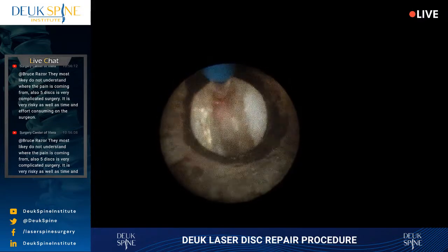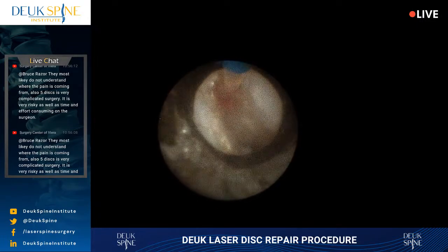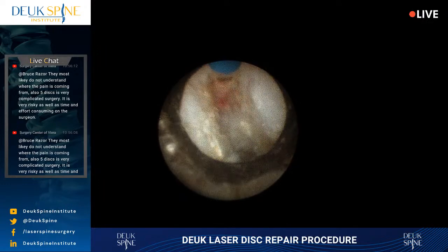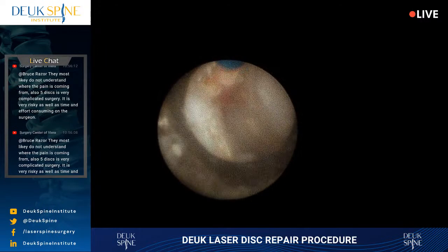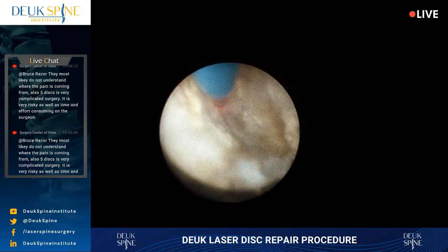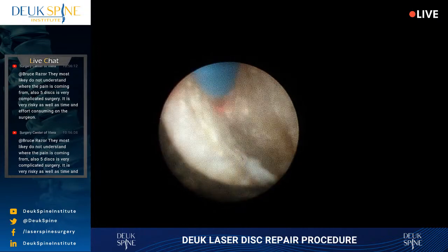All right, so already starting to see a little more movement at the back of the disc here. Luis, are you able to get more of these tubes as well? These ones are hard to get. I know, but you've got to get them. Either you find them or have them made. Okay, you understand what I'm saying? There are companies that make stuff, and you have to talk to them and say, hey, can you make this tube identical?